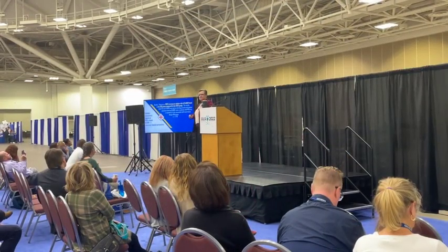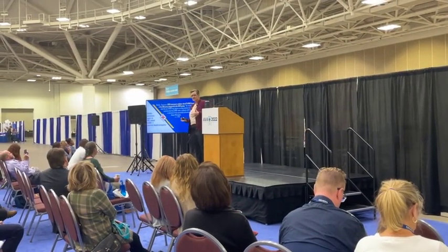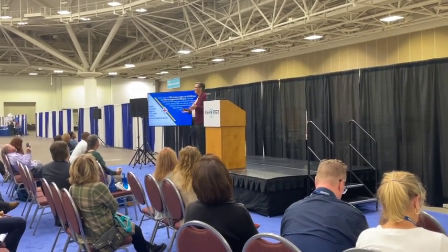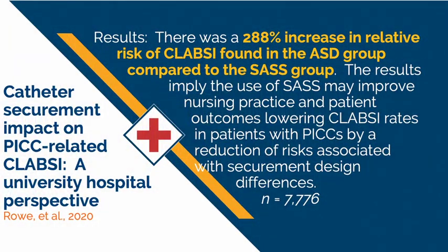Okay, so just to throw this out there, there was a very good paper done by Mark Rowe, don't know if he's here, there he is, yeah, where he looked at almost 8,000 patients, and this is what they found. There was a 288% increase in relative risk of CLABSI found if they used some sort of adhesive securement device versus, I can say it, SecureCath. Great fun.